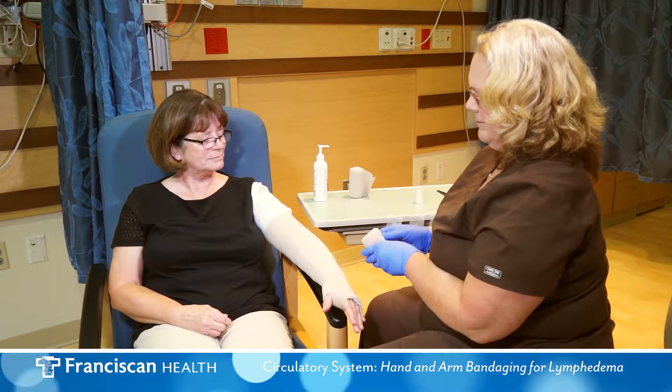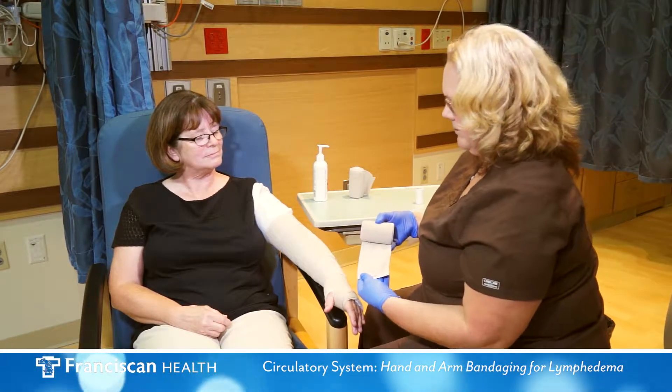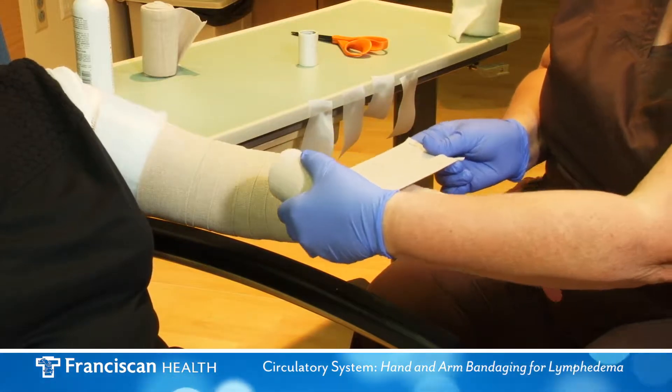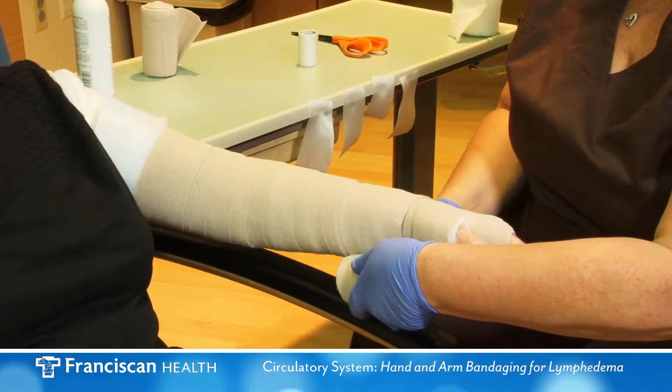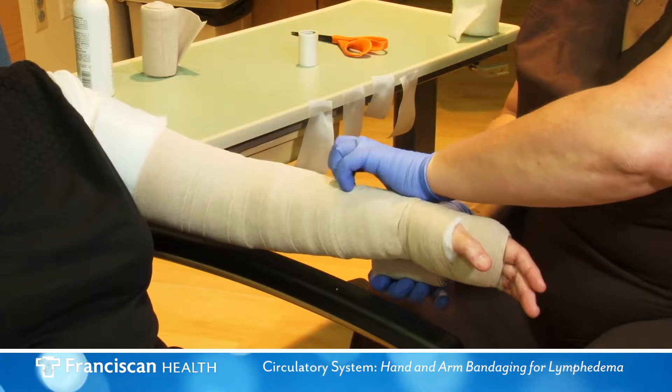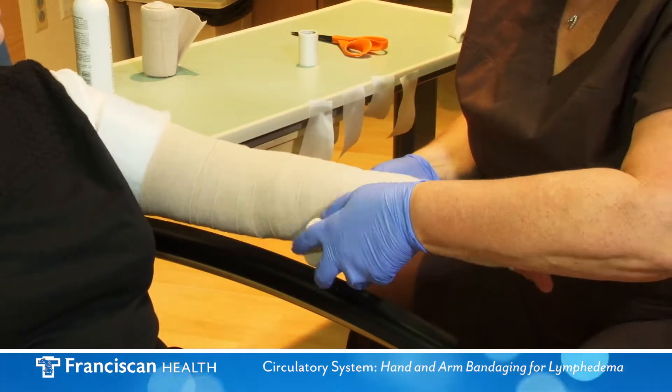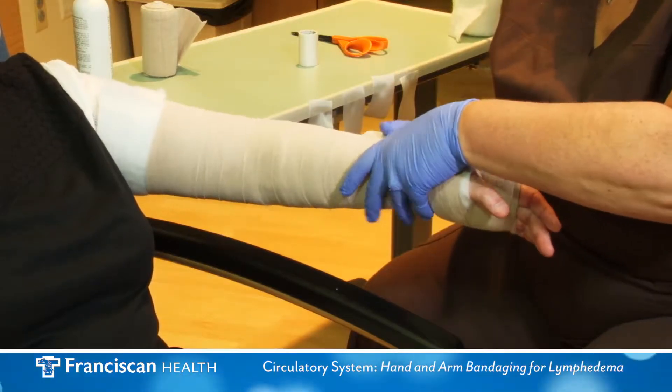Third bandage: use the next largest bandage in your kit. Begin in the reverse direction on the lower forearm. Cover the forearm and elbow in a spiral fashion. Keep moderate to strong tension on the bandage until you reach the armpit.